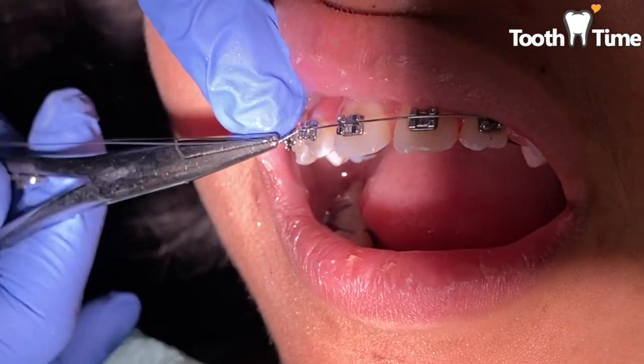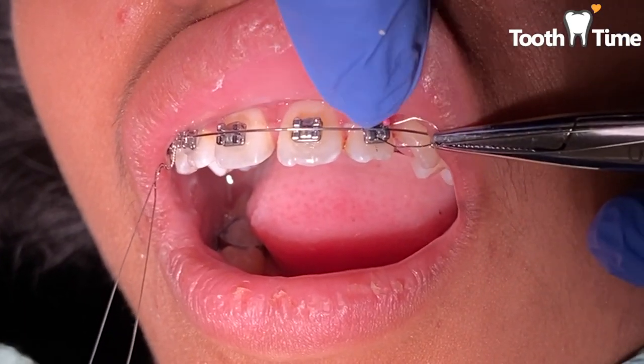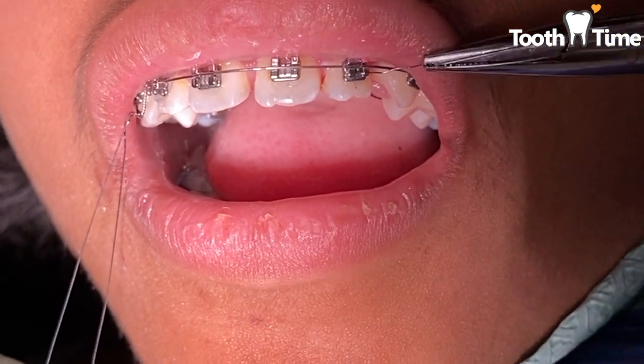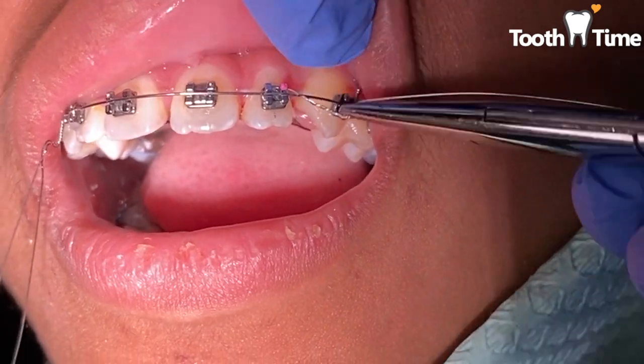As you can see here, we are tying the upper teeth, which are the laterals on the top of your teeth, because the patient is going to have a tooth-to-tooth chain.